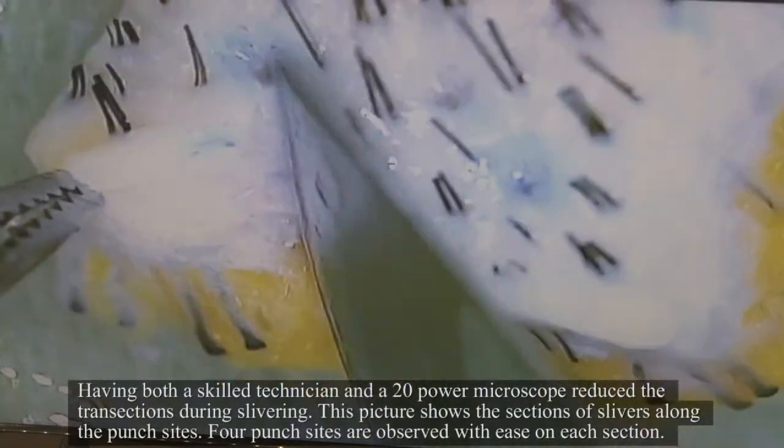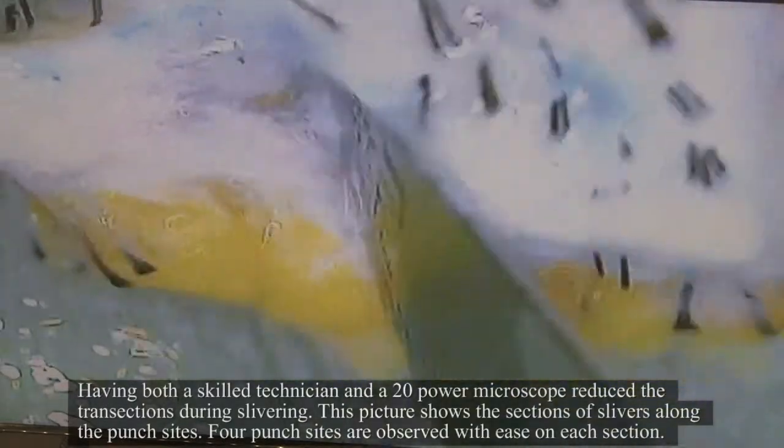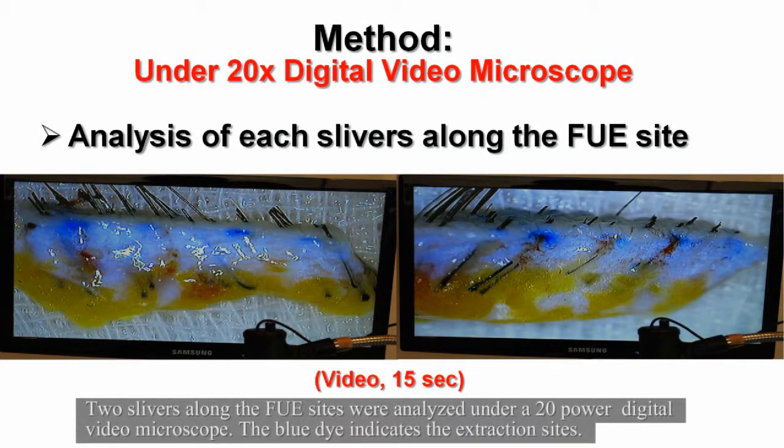This picture shows the sections of slivers along the punch sites. 4 punch sites are observed with ease on each section. 2 slivers along the FUE sites were analyzed under a 20-power digital video microscope. The blue dye indicates the extraction sites.